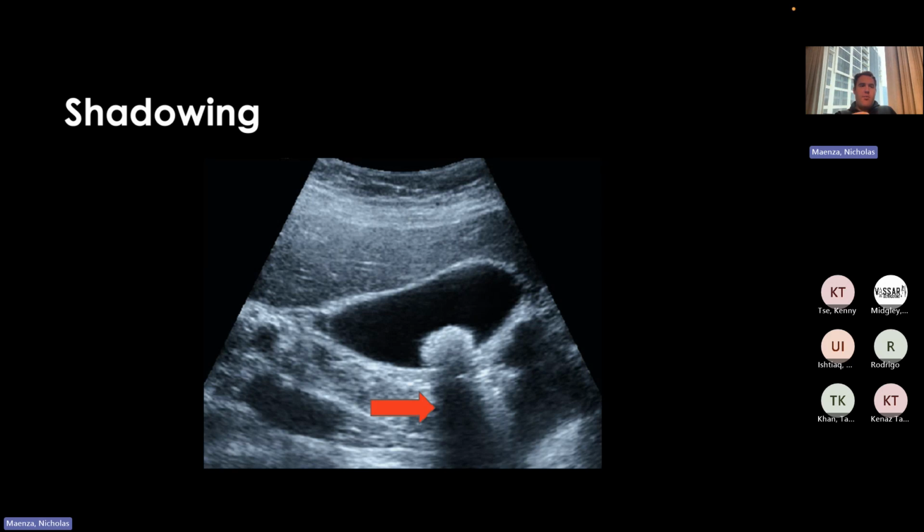The moment you hit that post in the middle of a pitch black basement, none of the light is going to go beyond it. So the light will light up the entire basement except when you hit that post, and that post won't let any light go beyond it, so you get that shadow. It's the same concept, but instead of a flashlight, you're using the ultrasound that's going down this way and creating this shadow down here.